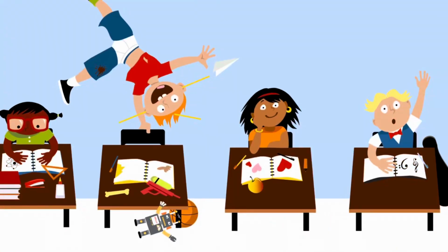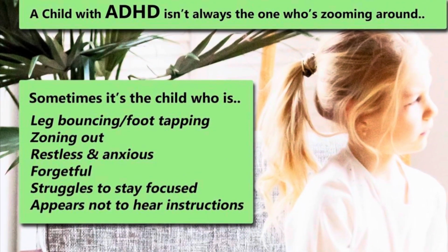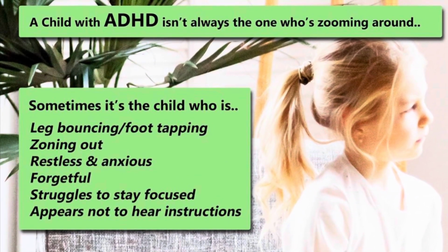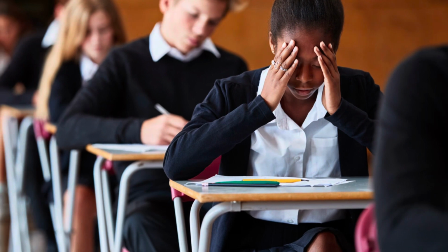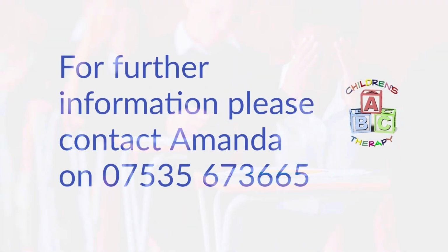Unlike the tick box assessments that are based on observation only, the QbCheck uses objective measures and is now recommended by the National Institute for Health and Care Excellence as part of the diagnostic process. Please note this is an assessment and not a formal diagnosis, so it's suitable for provision of school support and an NHS referral, but not for medication.